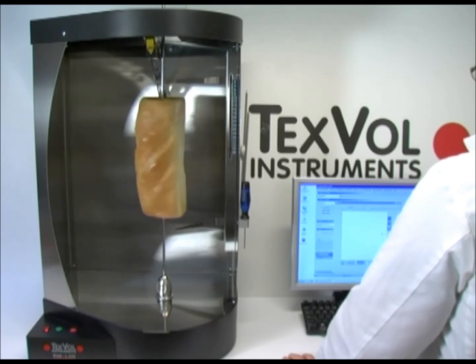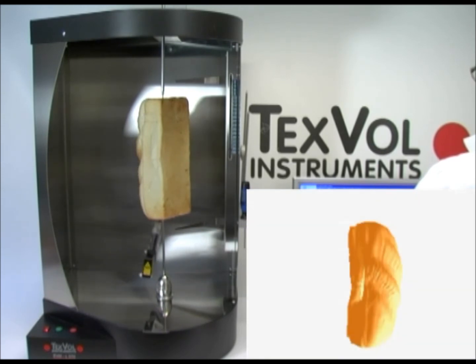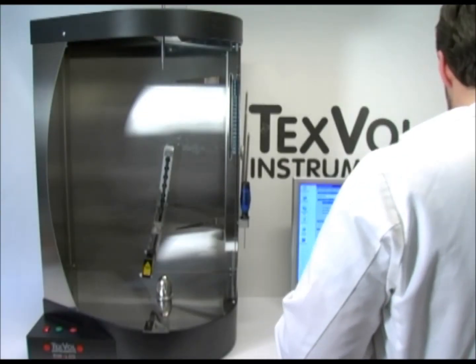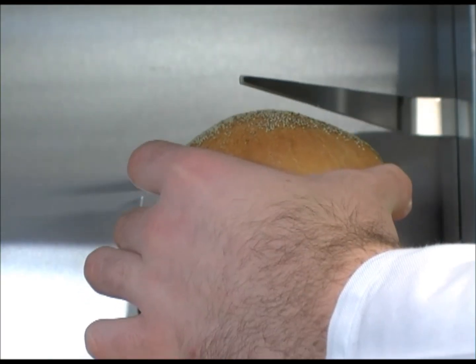When the measurement is ready, results are presented. Firstly, a three-dimensional rotational picture. Secondly, a table with multiple data on volume, dimensions, area, and density. Here we are only showing another bread type, but the operational procedure is the same.